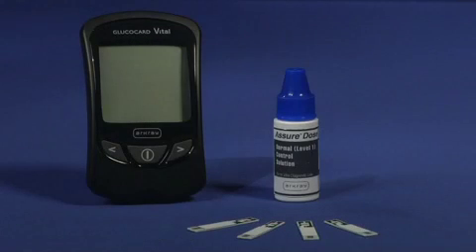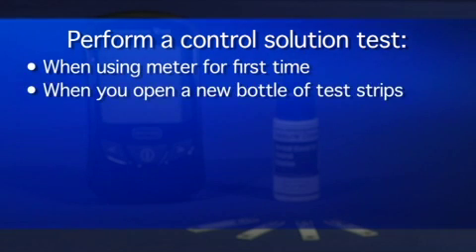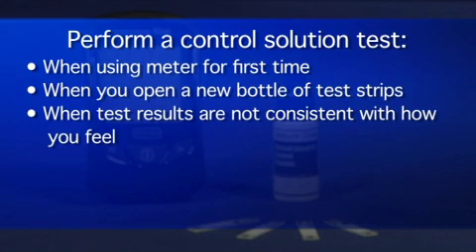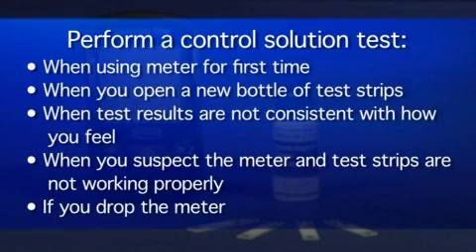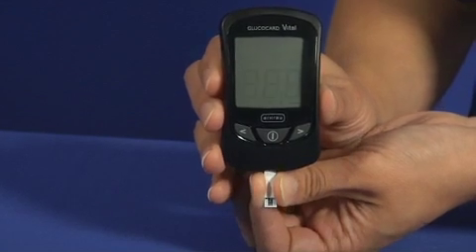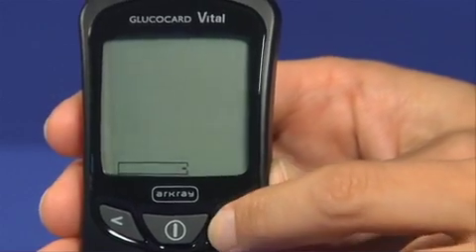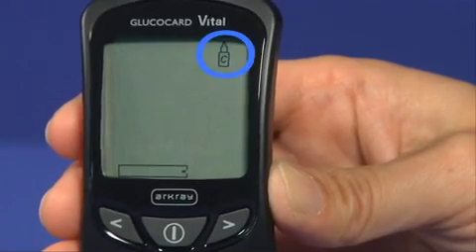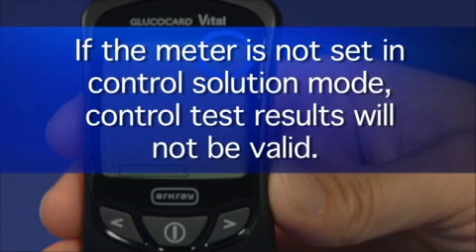To perform a control solution test, you will need your Glucocard Vital Meter, test strips, and control solution. It is recommended that you perform a control solution test when you use the meter for the first time, when you open a new bottle of test strips, when test results are not consistent with how you feel, when you suspect the meter and test strips are not working properly, or if you drop the meter. Insert a test strip into the meter and press the back or forward button until the control solution bottle symbol appears in the upper right corner of the screen. If the meter is not set in control solution mode, control test results will not be valid.